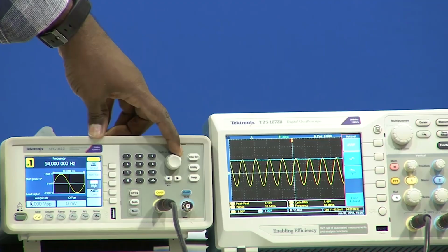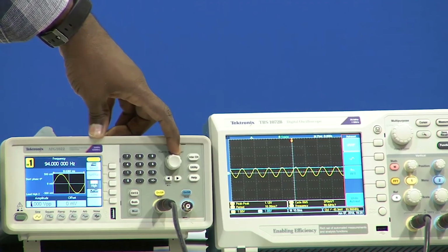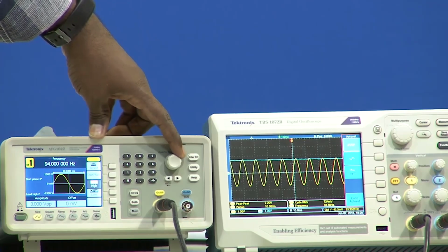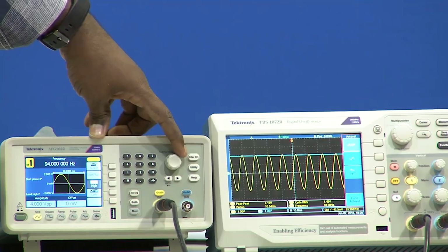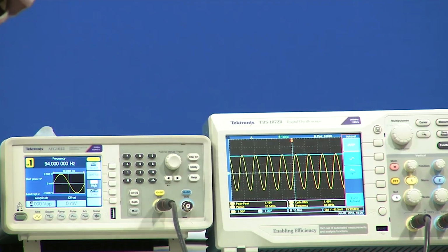So whereas when I am decreasing it, we can observe that the capacitor is slowly discharging, but when I am increasing it, we can see a quick, rapid change of going to the peak value. So that means we can understand that with this circuit we can easily find out the peak value of the input signal, right. So the peak detection part is done.